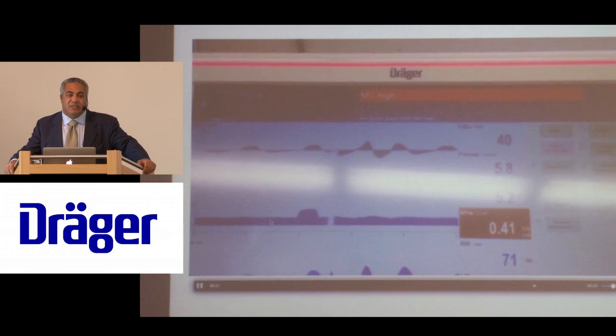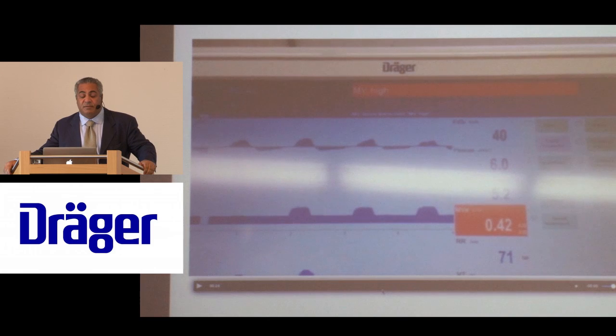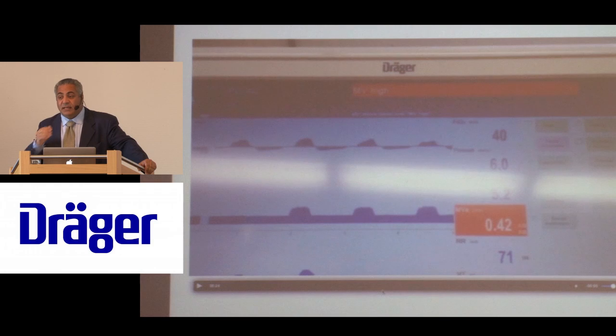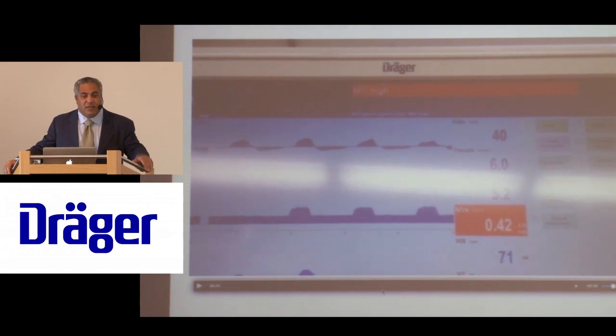And so you can mistakenly look at this and say the patient is not really using a lot of support. And frequently the tidal volumes are higher than what you want to set. A good example of that is the OSCAR trial. If you look at the OSCAR trial, they wanted to do 6 mLs per kg. They used PRVC, excuse me, and they actually ended up close to 10 mLs per kg, because what you set and what the patient is going to get is completely different. So if you really want to control tidal volume, you'll have to fix the flow.